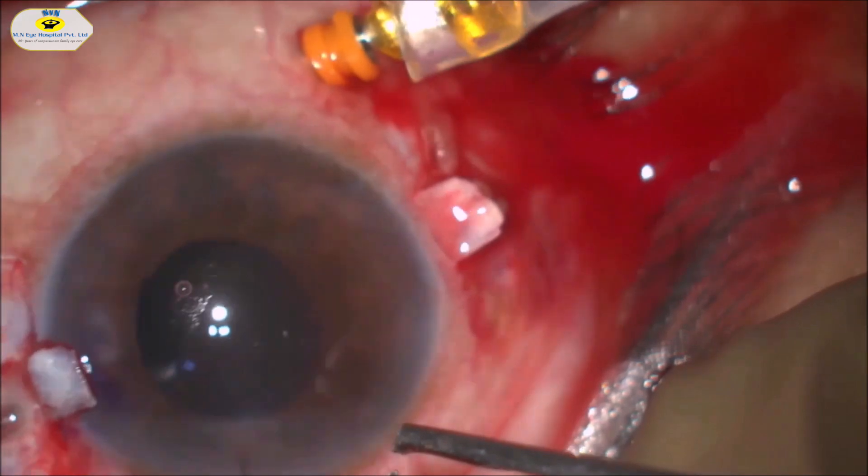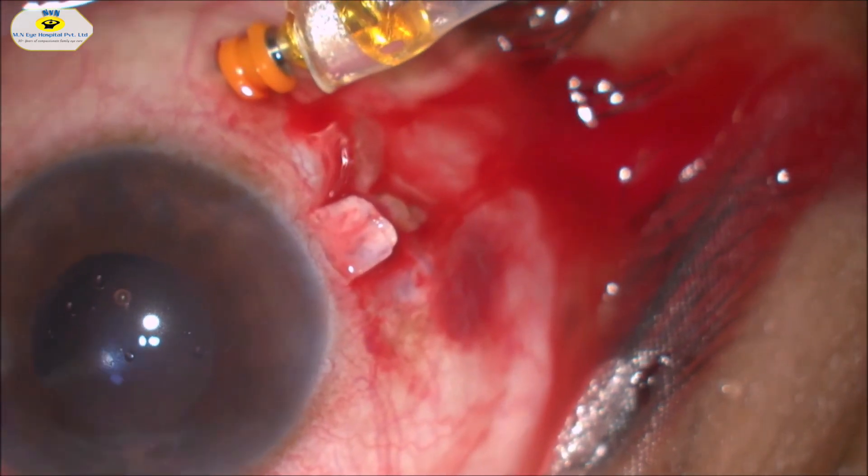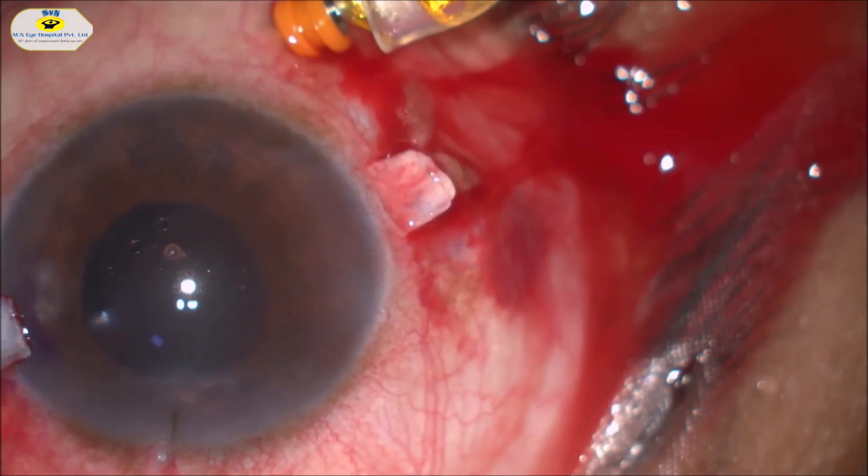The illumination probe is passed through the sclerostomy site. 3-port pars plana vitrectomy is done after injecting triamcinolone. First, the vitreous in the pupillary plane is cleared off, then core vitrectomy is done without disturbing the intraocular lens.